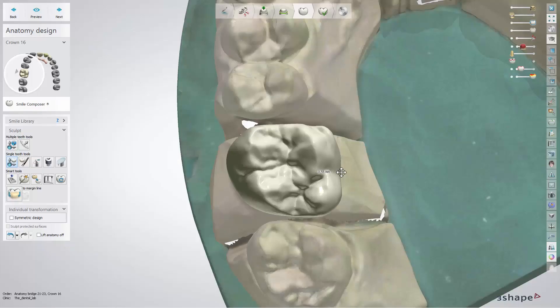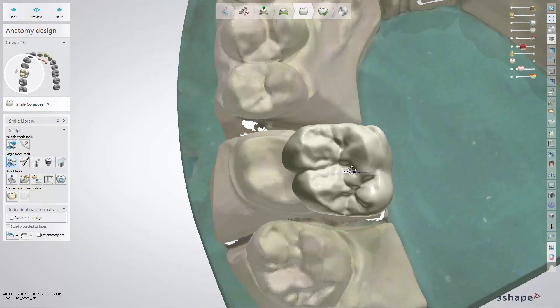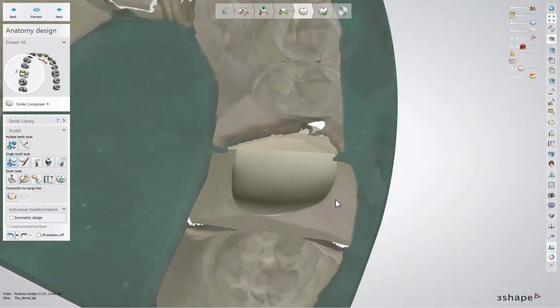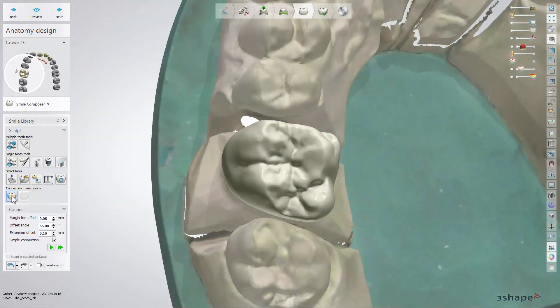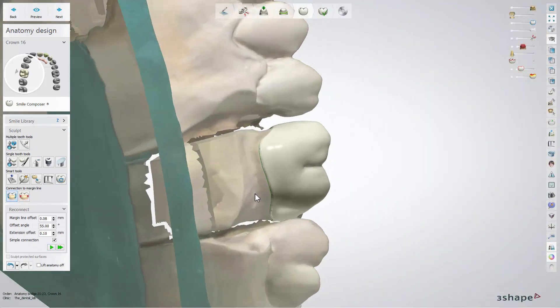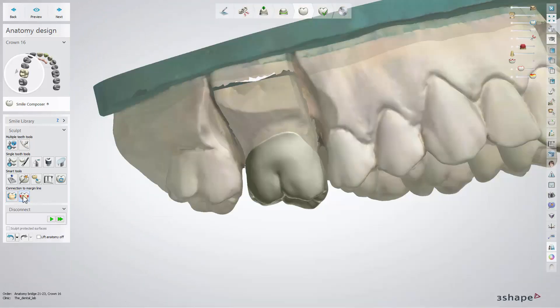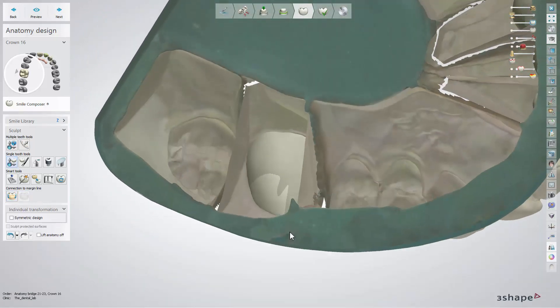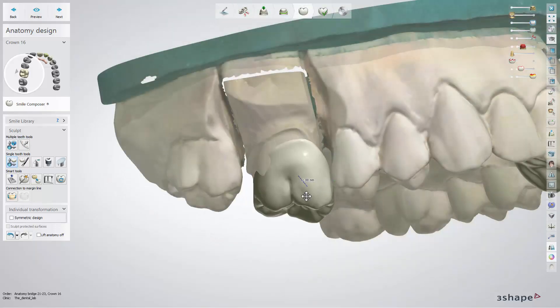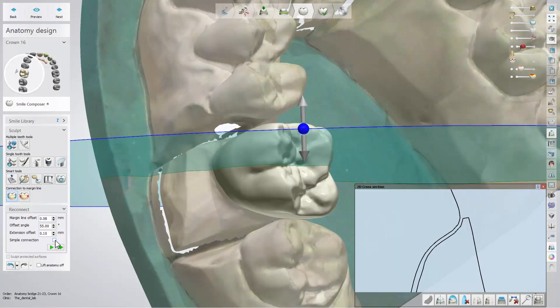The connection to the margin line tools allow you to connect the designed anatomy to the margin line, and disconnect it if needed. While connecting to the margin line, you have the possibility to adjust the connection settings. The simple connection checkbox allows you to connect the design to the margin line without applying extra smoothing to the anatomy near the margin line, keeping the design unchanged.